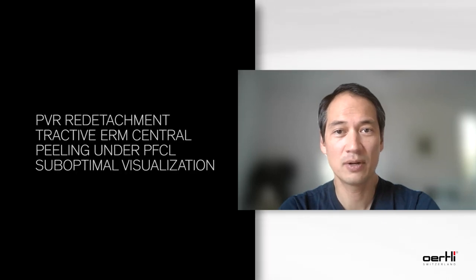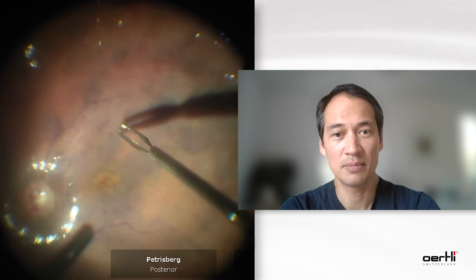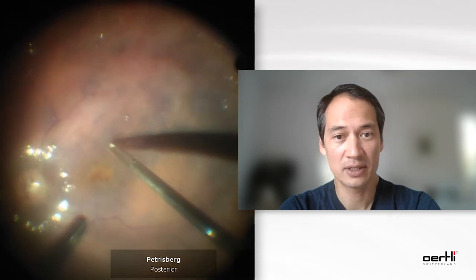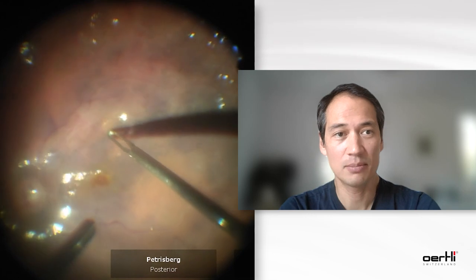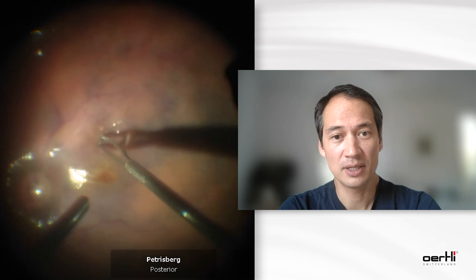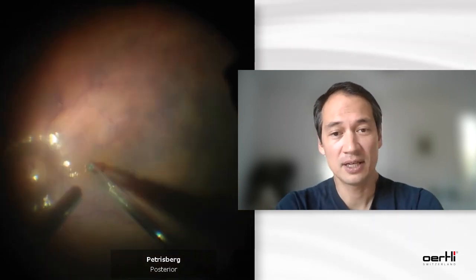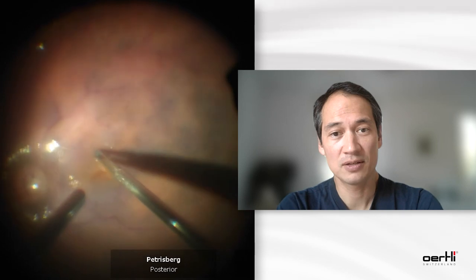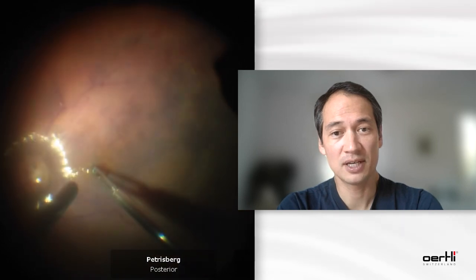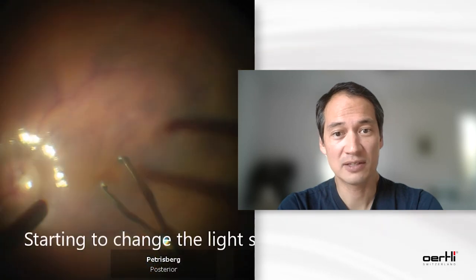It's a really quick one. So that's a patient case of a PVR detachment, and it has an epiretinal membrane, and I always do peeling in those cases. Now what you can see here is a peeling after I put in ILM dual blue, and I try to peel under PFCL. I always find peeling under PFCL a bit more challenging because the visualization isn't that good. If you look at the picture, you see that I'm not really making progress there.